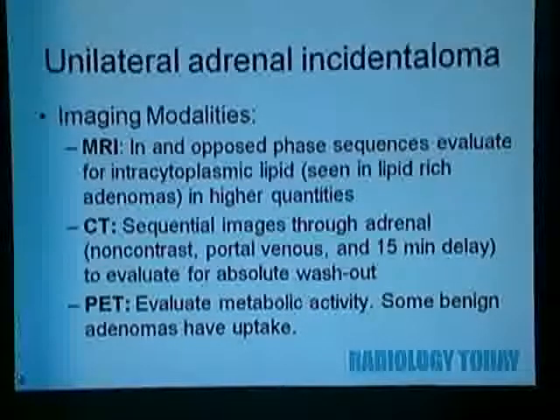Now, if it's of a higher density, we'll move on to portal venous and 15-minute delayed to evaluate for an absolute washout. And if it's greater than 60%, then it's characteristic of an adenoma as well. And in some problem-solving cases, PET has been used in some institutions to evaluate for metabolic activity. In itself, it is not a reimbursable indication at this time. It would have to go through NOPR, the National Oncologic PET Registry, to be approved at this time. But with PET imaging performed for other reasons, say workup of lung cancer or breast cancer, we sometimes see hypermetabolic nodules, which are worrisome then for metastatic disease.